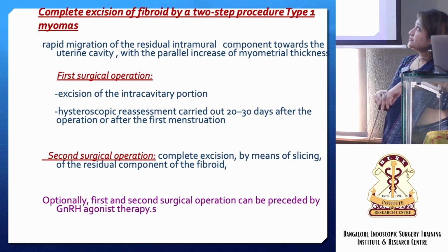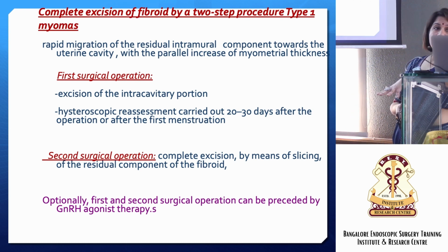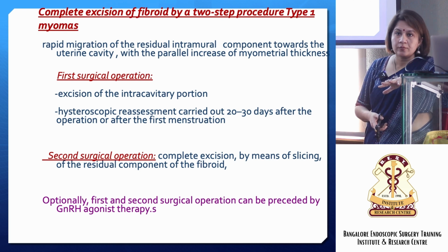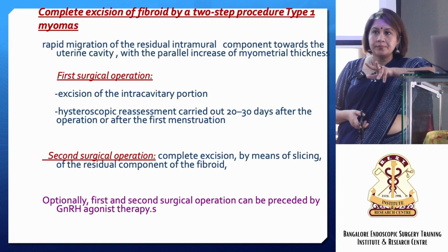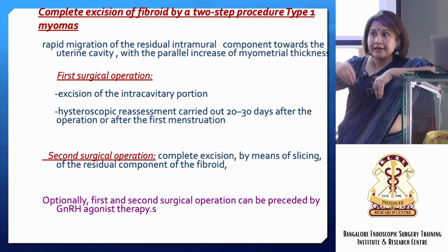Then what is important is how do we tackle type 1 and type 2 myomas. For type 0, you'll reach the base. But for type 1 and type 2 especially, the intramural part is going to be a challenge. So how much to dig in and take it?